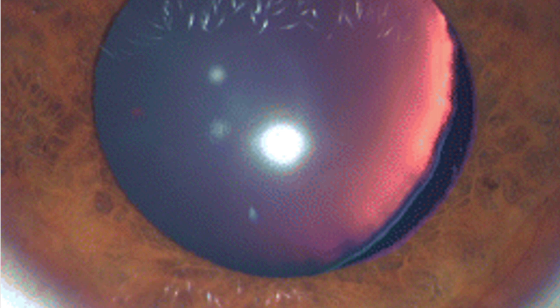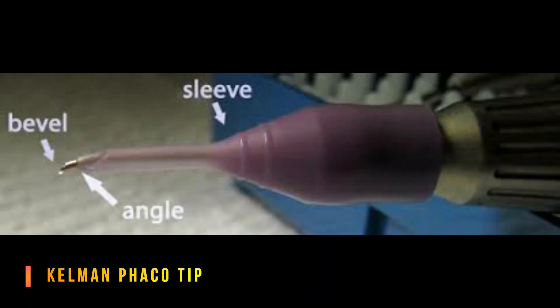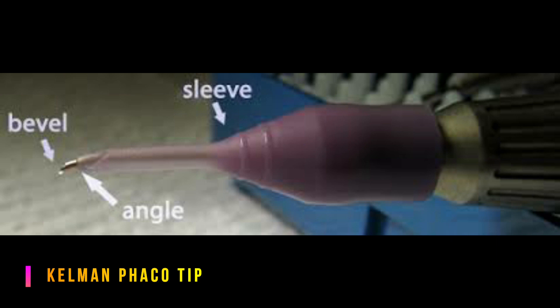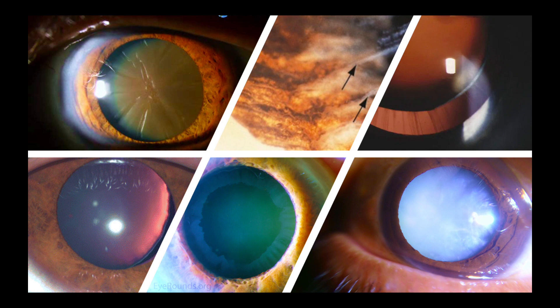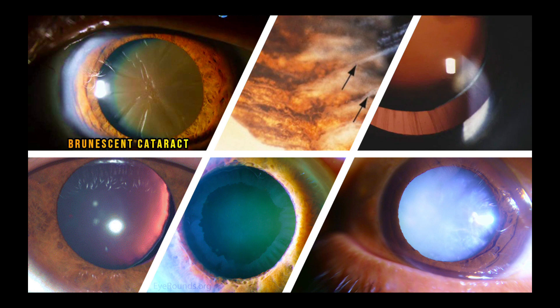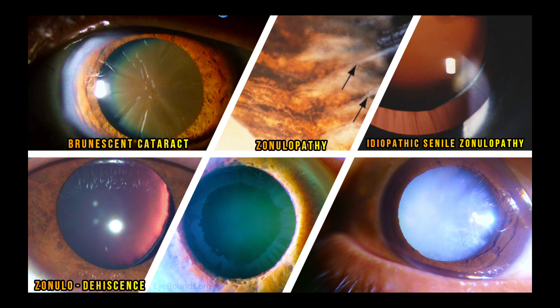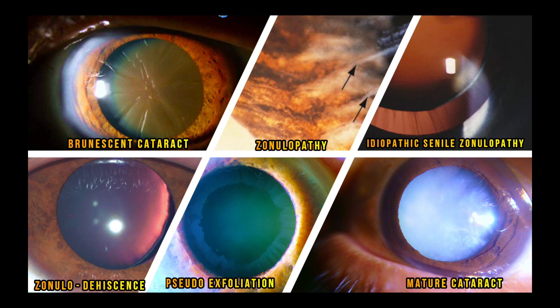A long chopper and Kelman tip — in which the tip is pointed backwards — increases the chances of PCT. A leaking side port is another factor that can cause the posterior capsule to move forward, resulting in an inadvertent posterior capsular tear.